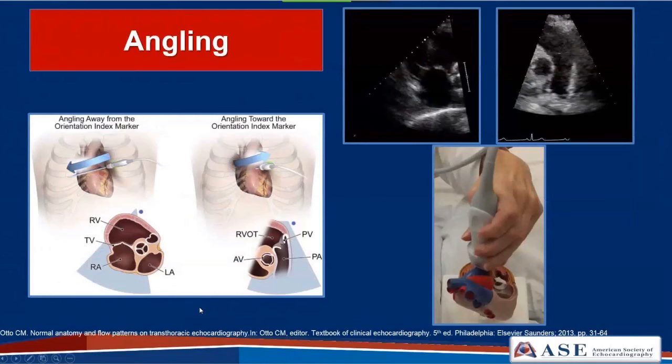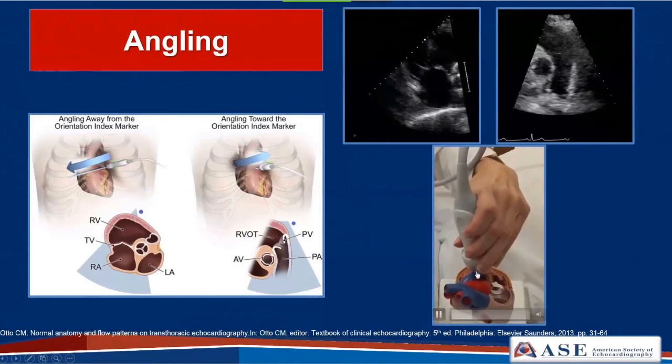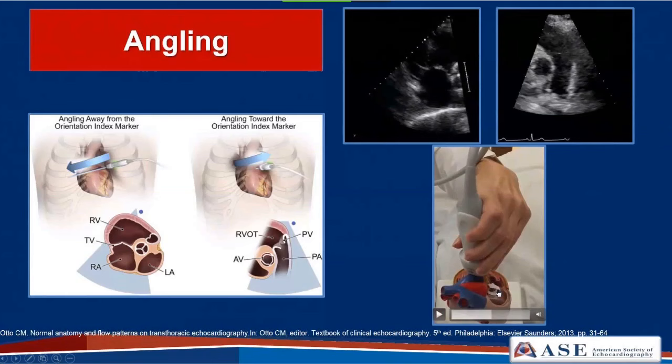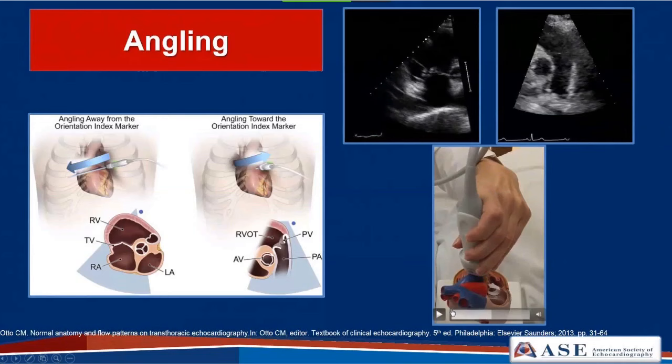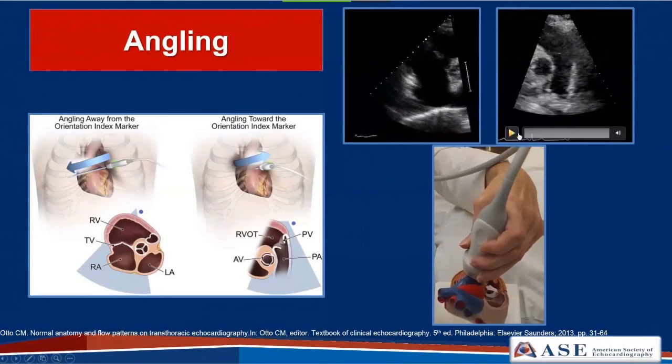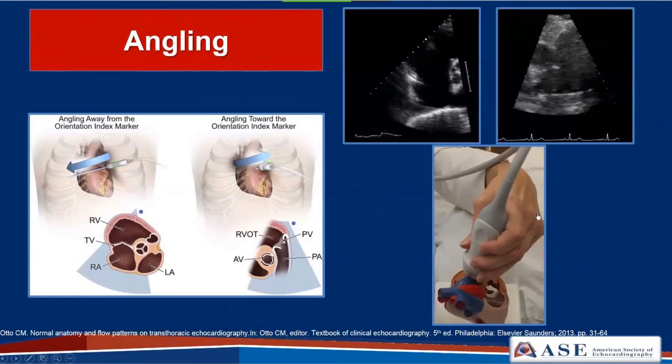Next we'll talk about angling—a small maneuver used to direct the sound beam towards a structure of interest rather than centering it. In this example, we angle rightward on the heart to demonstrate and focus in on the tricuspid valve, where we see the right atrium and tricuspid valve. Angling more leftward, we can focus in on the pulmonic valve, seeing the RVOT, the pulmonic valve, and the main pulmonary artery.